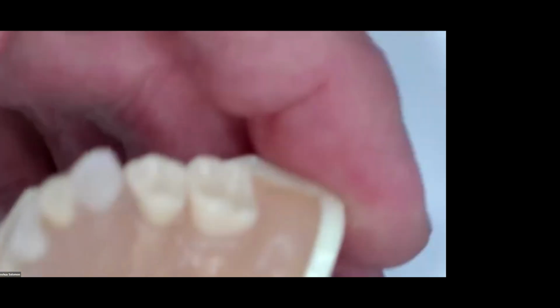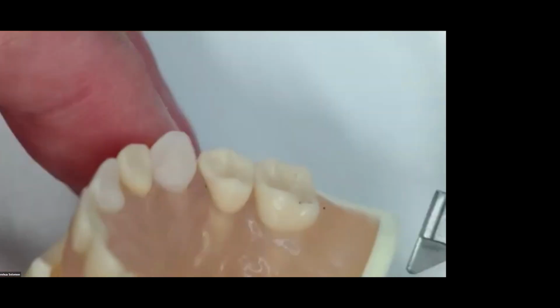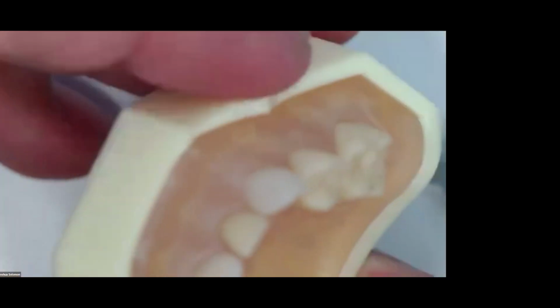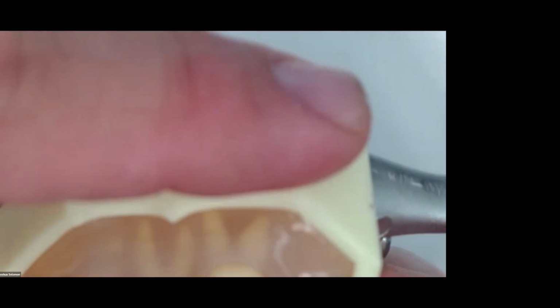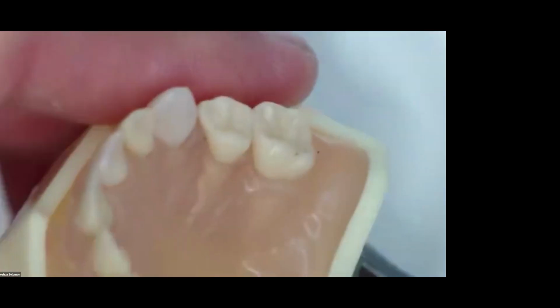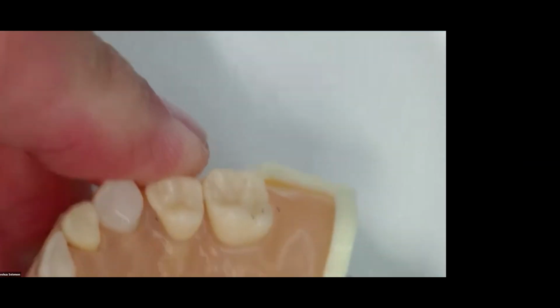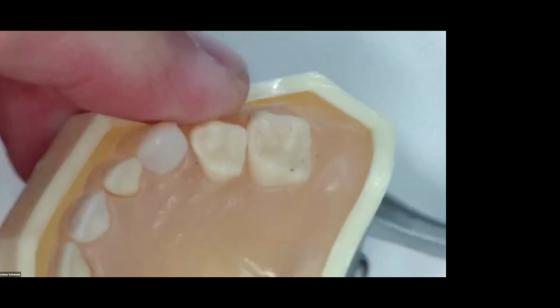And that's why my choice really, if I'm working on I and J, I'm going to give palatal. Now, could you rotate your patient's head all the way around? Absolutely, you could do that, right? But I just think it's a little easier to slightly rotate and come in palatally there. Okay.